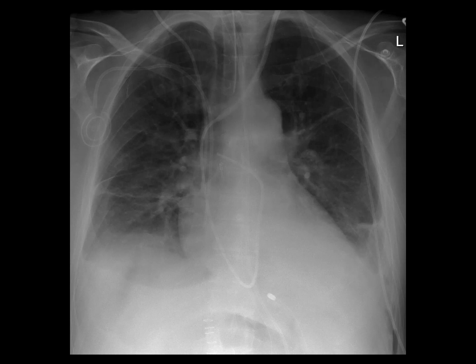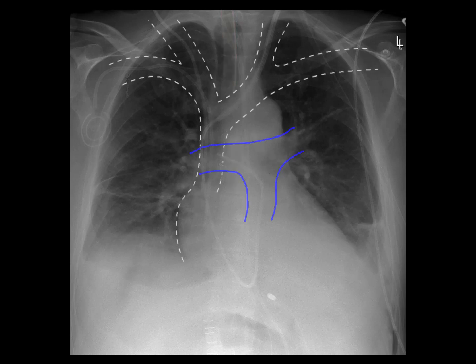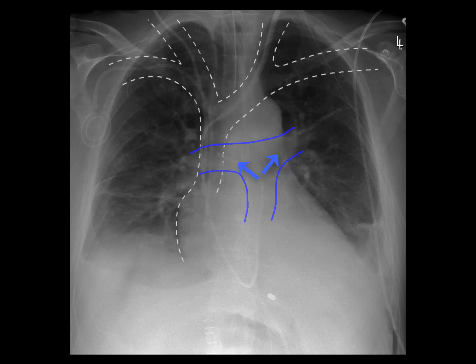The first device I'd suggest looking for on every image is the endotracheal tube, checking its position relative to the carina. Next, I suggest you look at the vascular catheters, and to assist you in that, we've outlined internal jugular veins, subclavian veins, brachiocephalic veins, and SVC, as well as the approximate location of the pulmonary arteries.